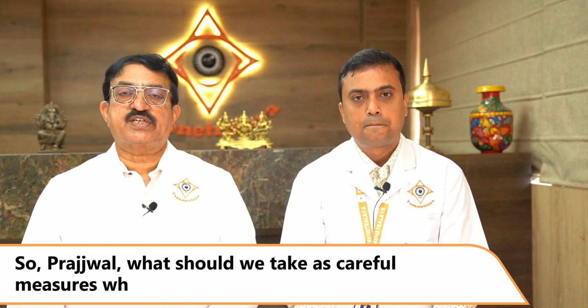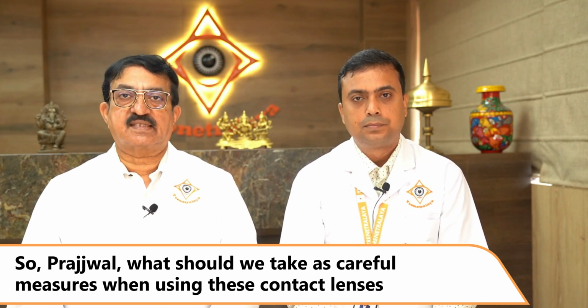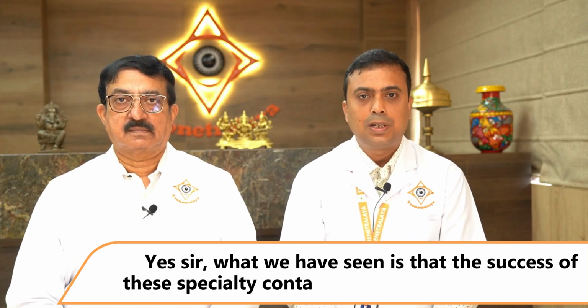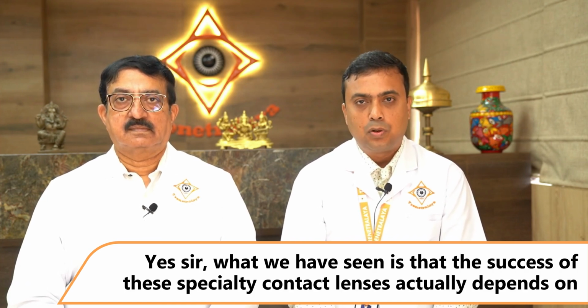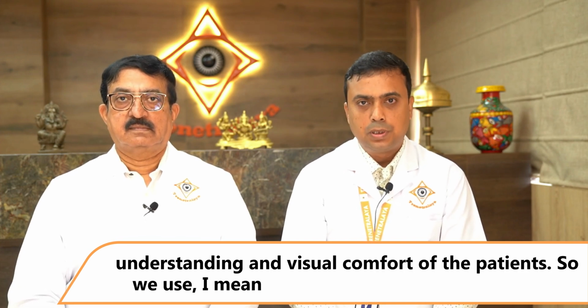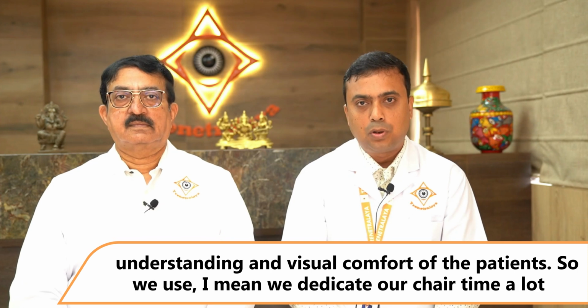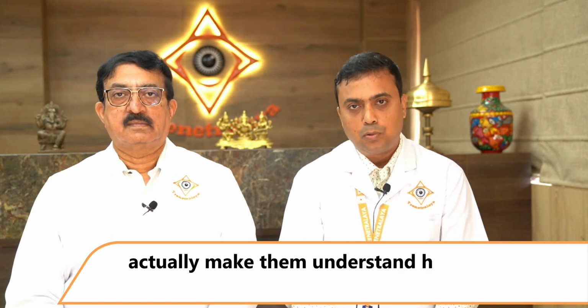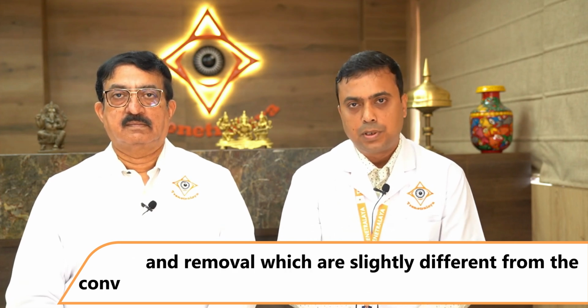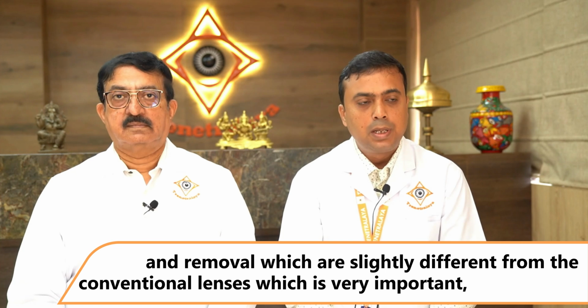Right. So Prajjwal, what should we take as careful measures when using these contact lenses? Yes, sir. What we have seen is the success of these specialty contact lenses actually depends on the understanding and visual comfort of the patient. So we dedicate our chair time a lot to actually make them understand how to use them, what to do and what not to do. Starting from insertion and removal, which are slightly different from the conventional lenses, which is very important.